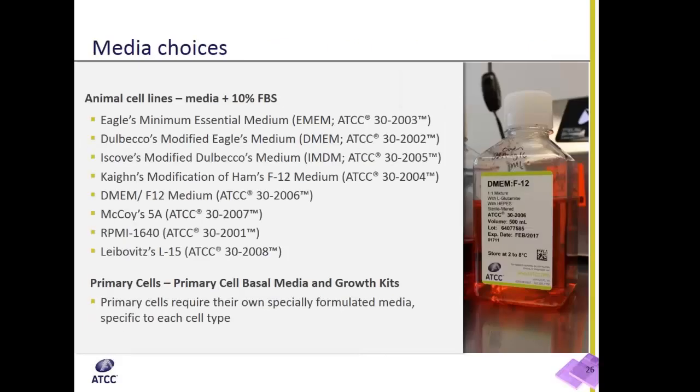So now we're going to switch and talk about some best practices with media choices and additives you can put into your cell culture media. Complete growth media refers to cell culture media, various ingredients and additives, and animal sera. In this section, we'll go over these fundamental components and give advice and guidance on how to manipulate growth media by adding additional ingredients, and also when not to add additional components to your cell culture media.